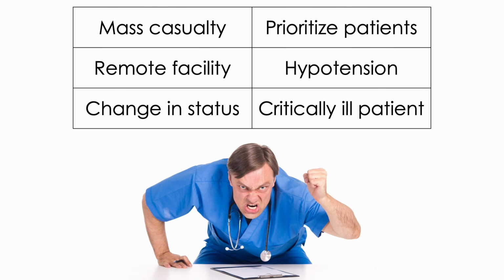Before you start thinking, why did we just spend this time learning the FAST if it's not that helpful? You should realize that the FAST scan can play a role in pediatric trauma. A number of scenarios particularly lend themselves to using the FAST in pediatric trauma patients. Imagine the utility of the FAST exam in a mass casualty situation. If you have a positive FAST scan at a remote facility, you'd probably transfer that patient out immediately.